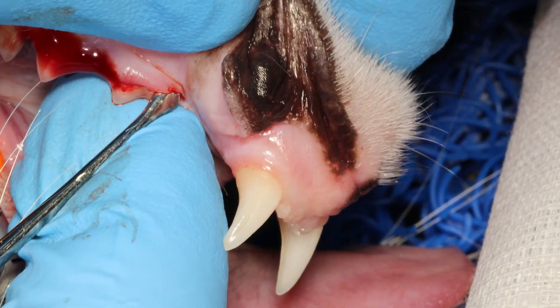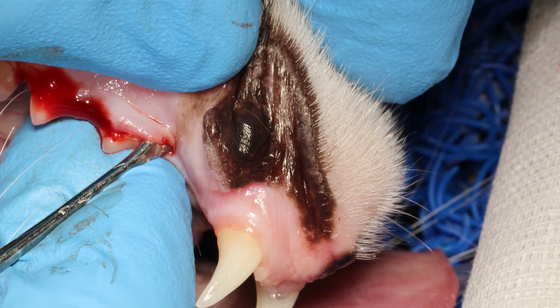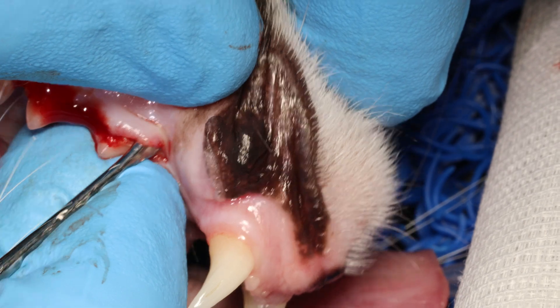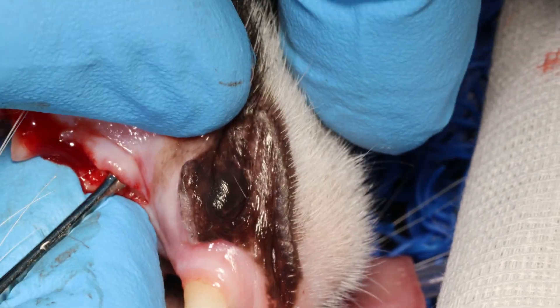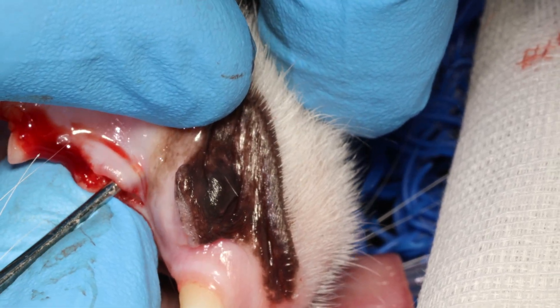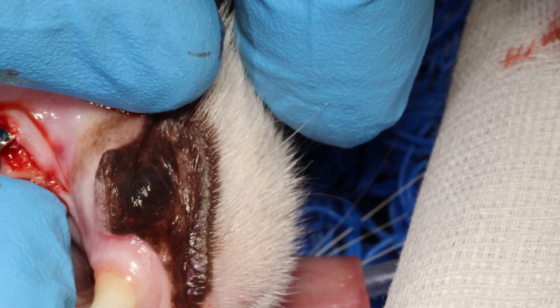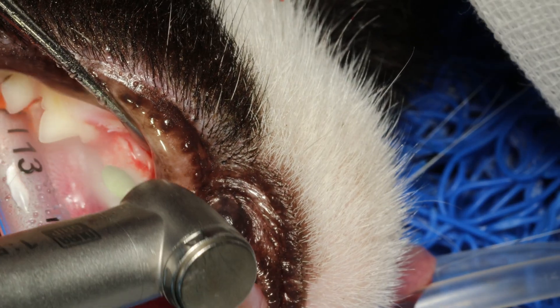Extend that envelope a little bit longer to make it easier to bypass that tiny tear and release it. Now I am getting a good release. As with all flaps you have to go deeper than the muco-gingival line — that straight line separating the gingiva from the soft and flexible mucosa. You can see how thin it is because the periosteal elevator when it slides underneath you can see through.